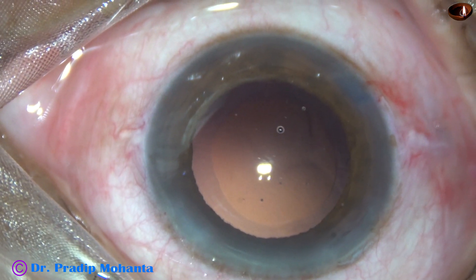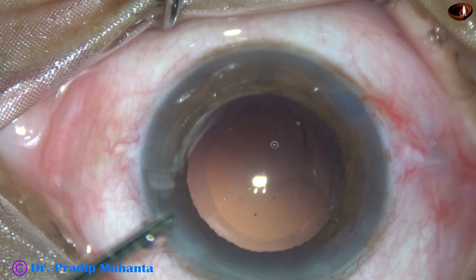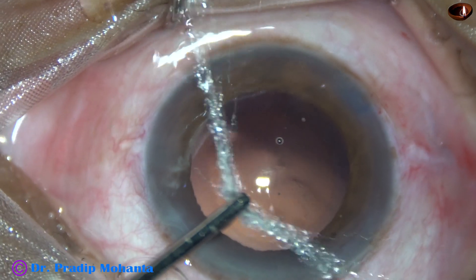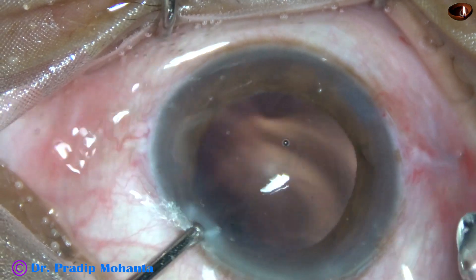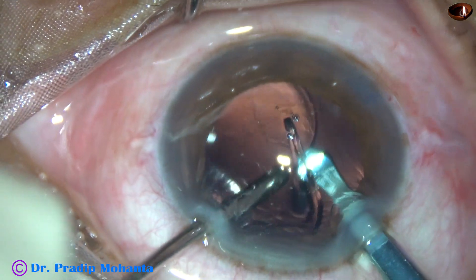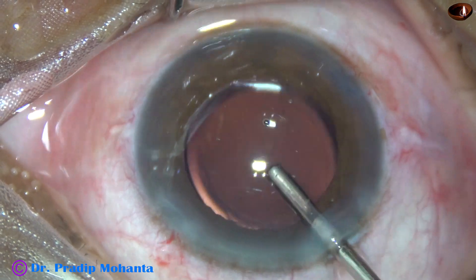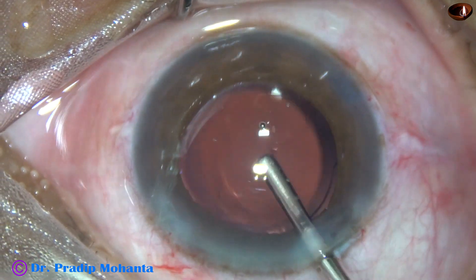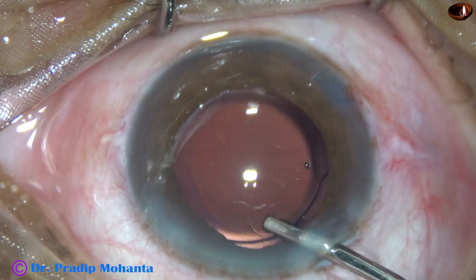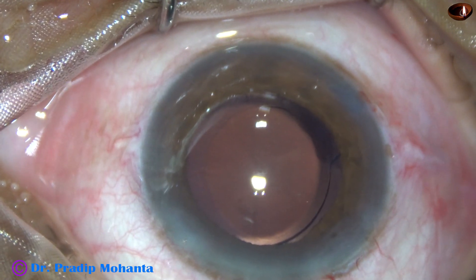Now it is time to implant an intraocular lens. In this case I have used a B cartridge, so I am going to enlarge the main wound a bit — from 2.8 mm to about 3 mm. A monofocal single-piece intraocular lens goes into the capsular bag. Both haptics have gone into the capsular bag; the trailing haptic goes in by a gentle push of the left-hand instrument.